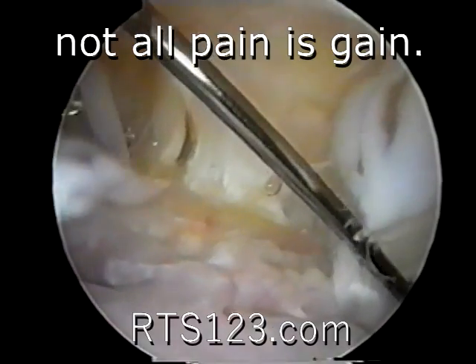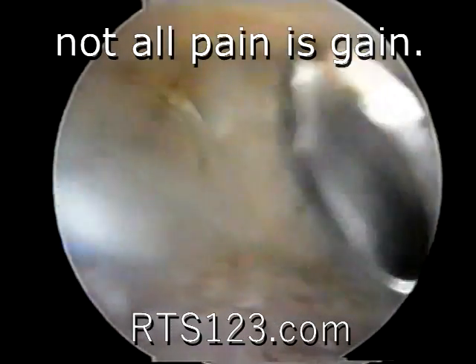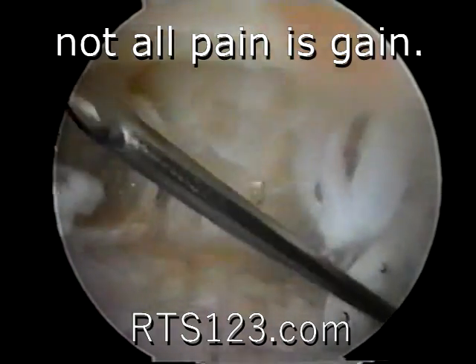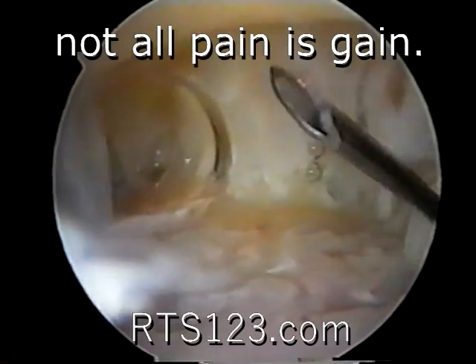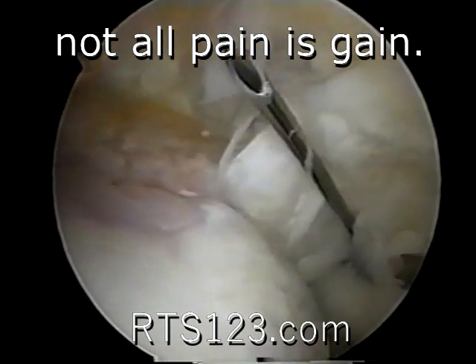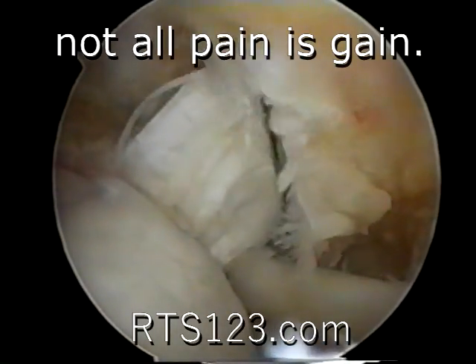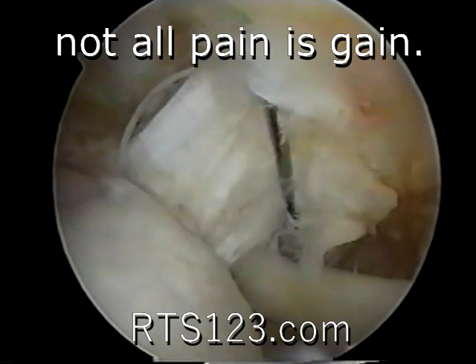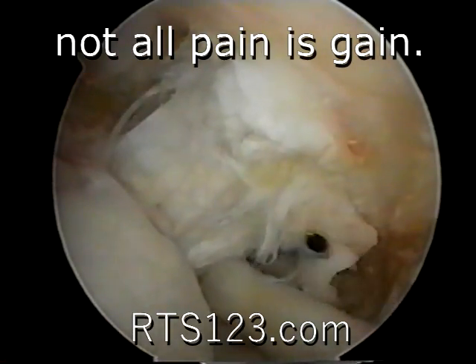Okay, now look in the background. You've got a nice surface of rotator cuff on top of that, and that's why your arthrogram dye did not leak out all the way through, and why our fluid's not leaking all the way through. So it's still an incomplete tear, but I mean, this shoulder's just not looking good, Jerry. We can only do so much to improve a beat-up shoulder, and I'm not sure we're going to be able to give you the relief you want to get back to training and weightlifting.